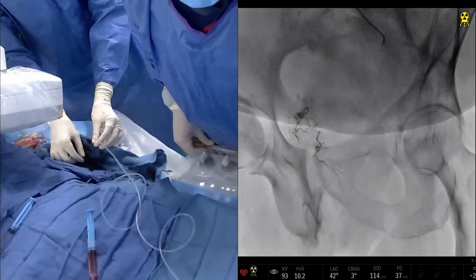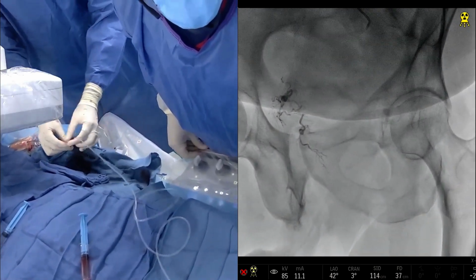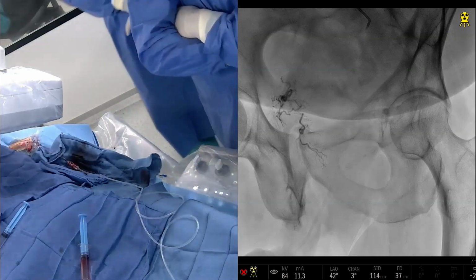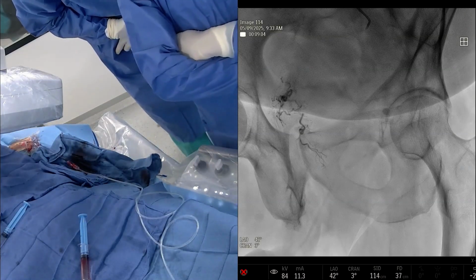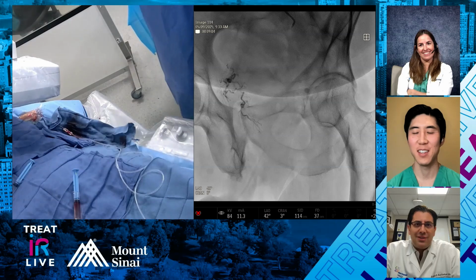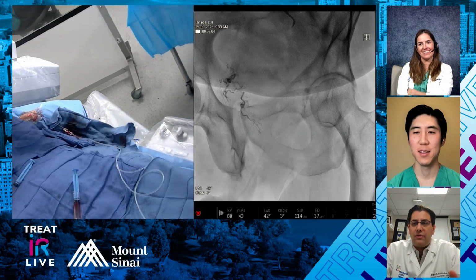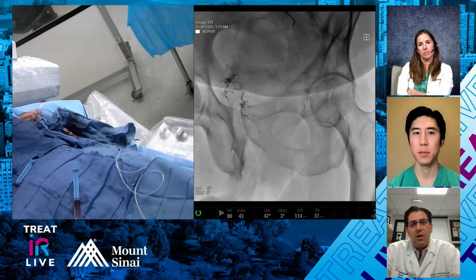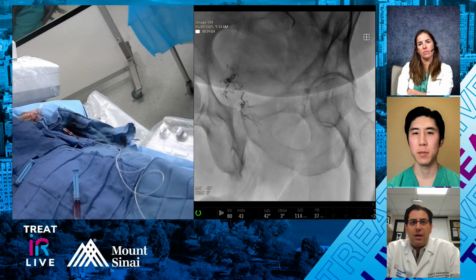As we hook up the injector, now, Art, Jeremy, what do you guys want to comment about cone beam CT, just to answer Dr. Garcia's questions? I think he was referring to me. I don't use cone beam CT to find the vessels. I do check before to see if there are any small collaterals, most likely they're clinically insignificant. That does increase my dose. I don't do a pre-op CT angio to plan, so there's a give and take there in that space.